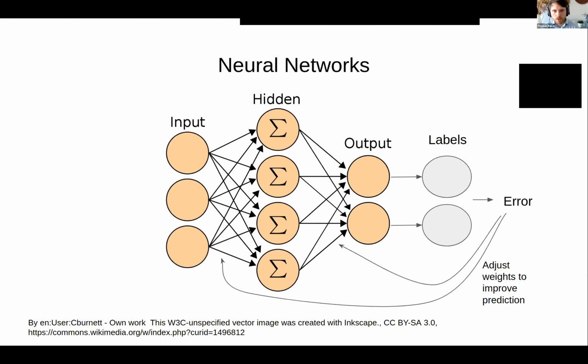Neural networks as such are not that useful for image processing because essentially everything is connected to everything else. That means you're not really taking into account the spatial distribution of the information. That may sound a little bit abstract, and don't worry too much about it. There's a version of neural networks used for image processing called convolutional neural networks.